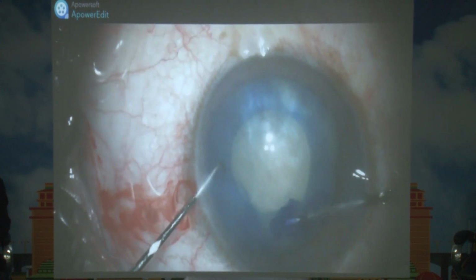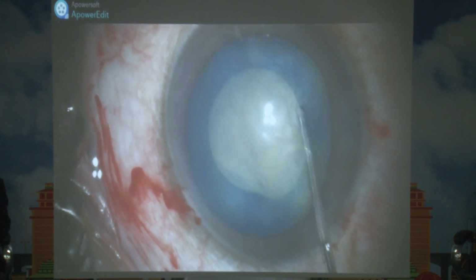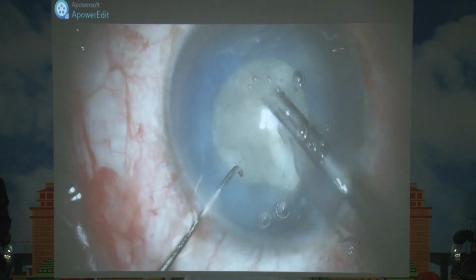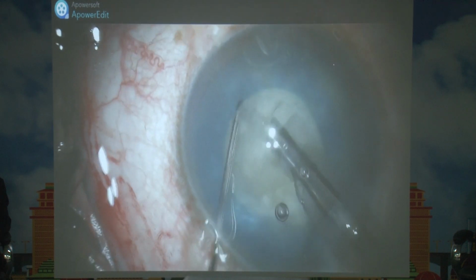Here we are making a spiral rhexis instead of a two-step rhexis. So it depends on how much control you have in your hand. If you think it's going well controlled, you can continue with the spiral. Otherwise, what works best is to make a small one and do a two-step. So here again the rest of the steps become easy.